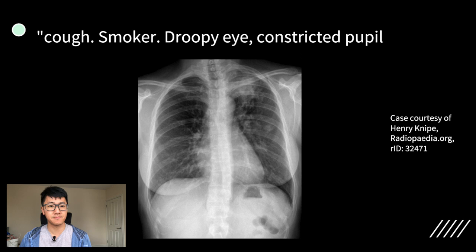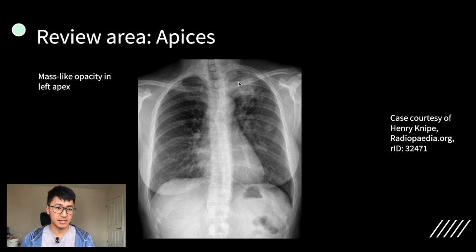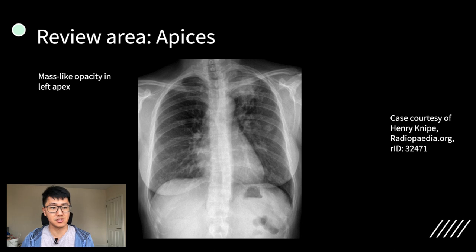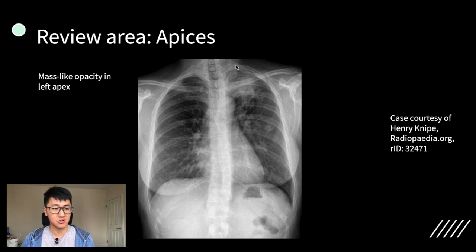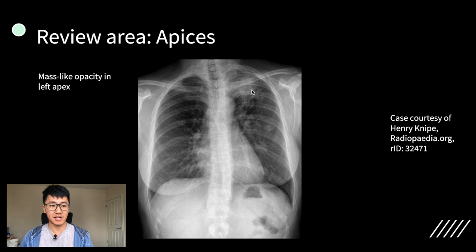Now try this one on for size. So here in the left apical region, you can see there is an ill-defined mass-like opacity. That combined with a history consistent with Horner syndrome, you think about something like a Pancoast tumour or a lung tumour in the apex. These things are really easily missed because there are so many structures in the lung apex, which is why you should deliberately look there. The other tip is to compare it to the other side and you can clearly see that it's more opacified.